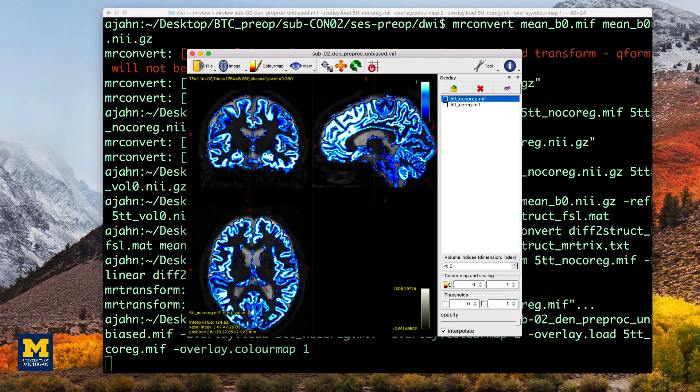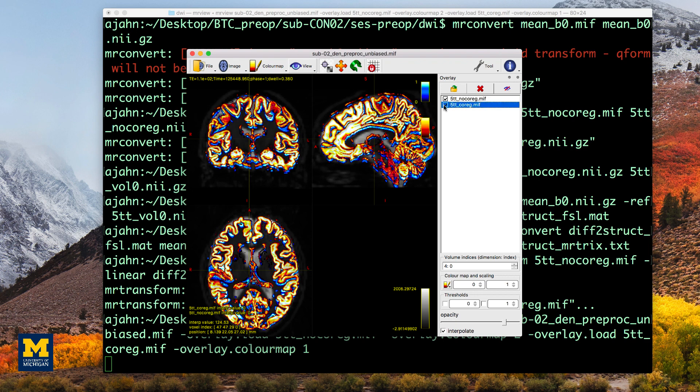In some cases, you may find that the co-registration from FLIRT does slightly worse or is a little bit off in some places as compared to the initial registration before you applied FLIRT. In other cases, it may work very well and fix some misalignments.